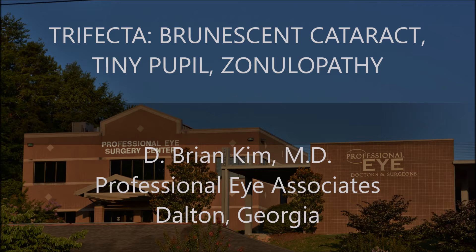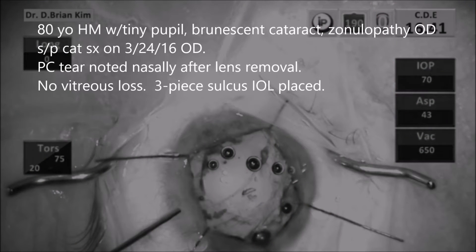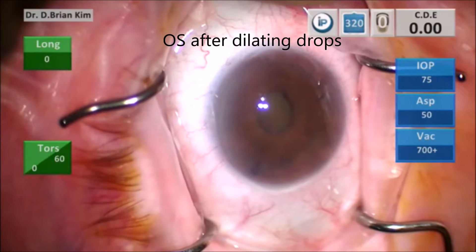This is an 80-year-old Hispanic gentleman who had a brunescent cataract, tiny pupil with zonulopathy in the right eye. After I removed the cataract I found there to be a possible tear in the posterior capsule, and although I didn't lose vitreous, I wanted to proceed safely and placed a three-piece lens in the ciliary sulcus.